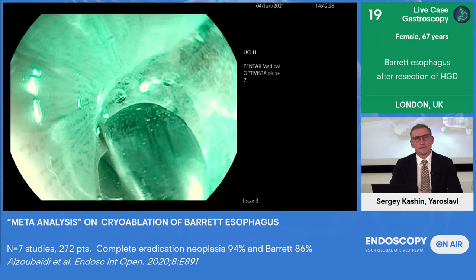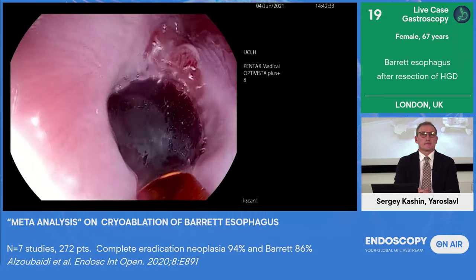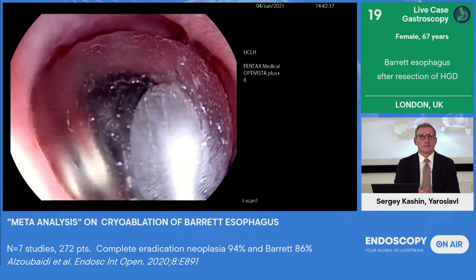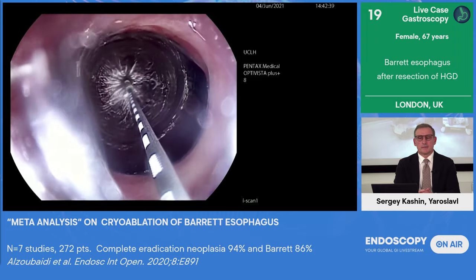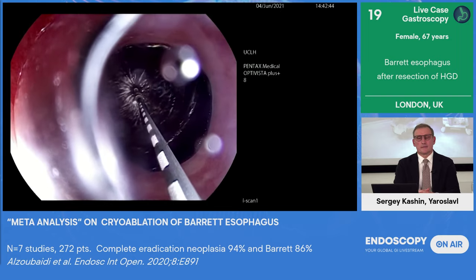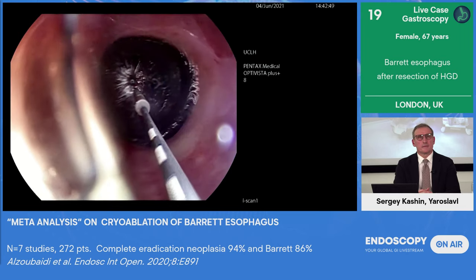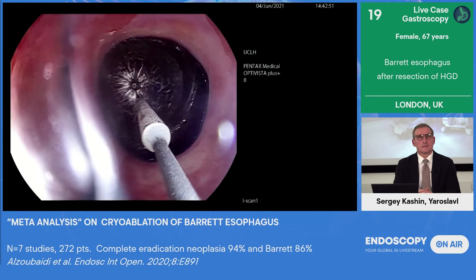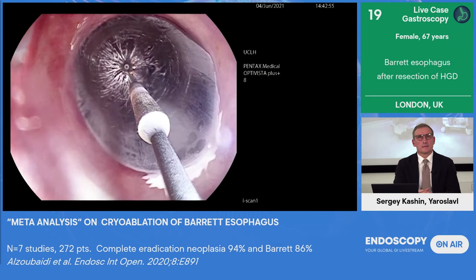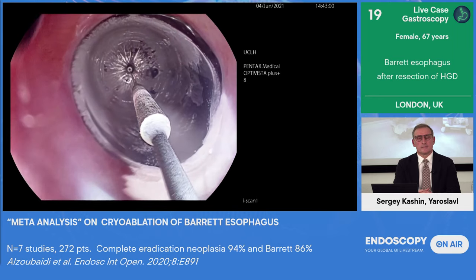So I'm just going to switch to my enhanced imaging here. And I'm just going to see if I can find a stable position just proximal to the stricture. And the key here is to move your scope into the balloon. There we go. And now what I'm going to do is bring the spray part of the catheter towards me. And then I'm going to start to ablate, and you'll see how I've got a nice stable position here. And you'll begin to see the ablation begin in the sort of 5 o'clock position.